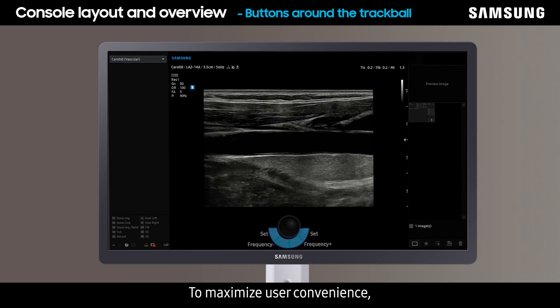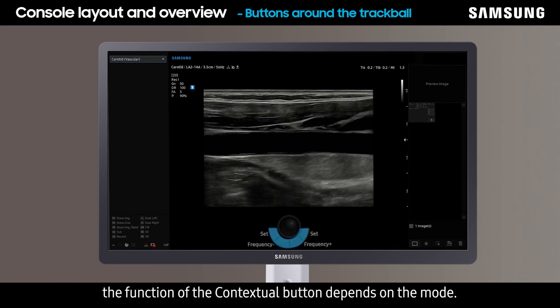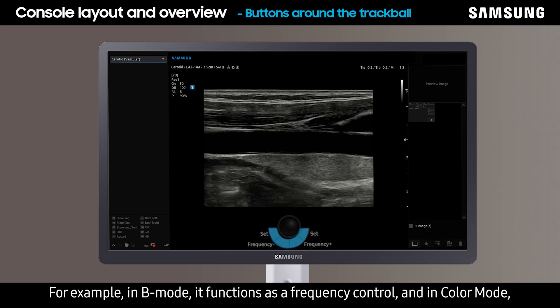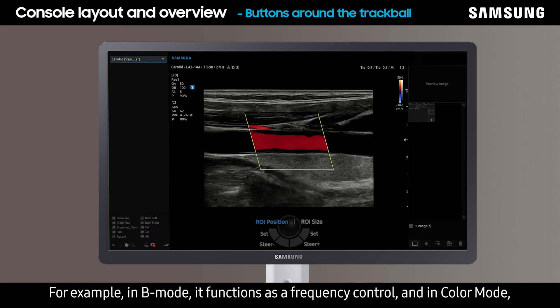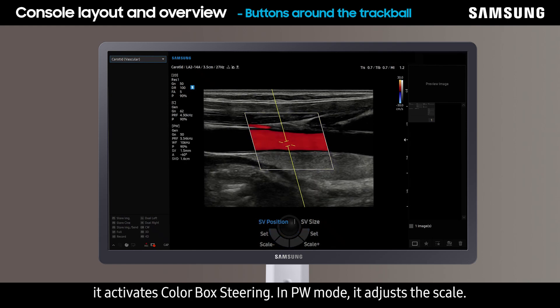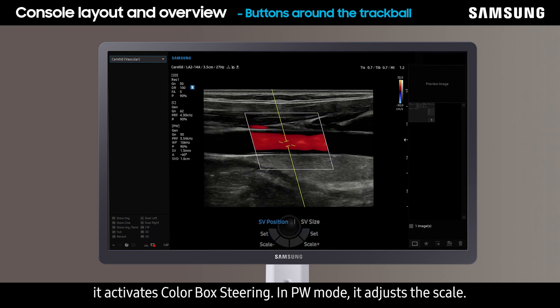To maximize user convenience, the function of the contextual button depends on the mode. For example, in B mode it functions as a frequency control. In color mode it activates color box steering. In PW mode it adjusts the scale.